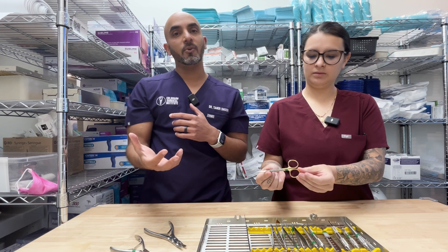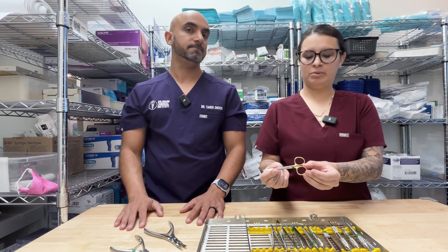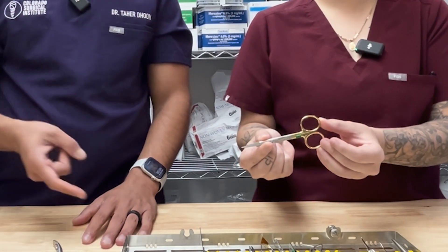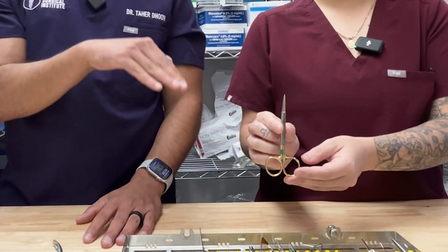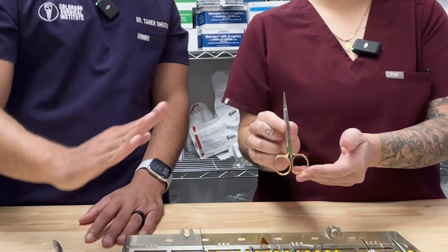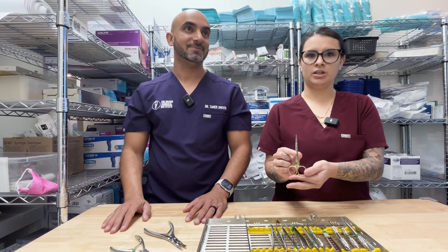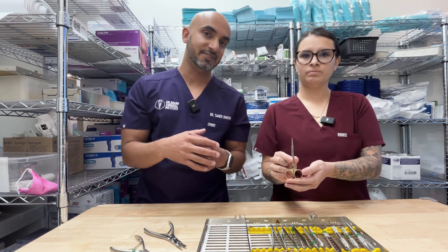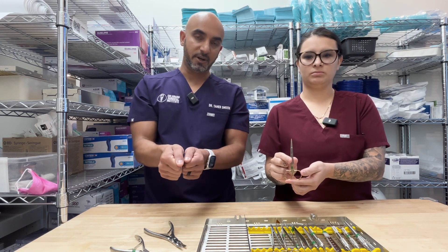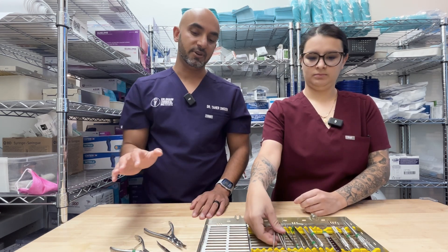These are our surgical scissors. Sometimes you might want to keep one or two in your kit — we just use one. We use them to cut excess tissue, but basically to cut suture, and also to cut PRF. You see how this one has a curve to it? With curved iris scissors, when you go to cut your sutures, you want to go in with that curved part pointing up — it makes it easier versus having the curved part facing down. Cut them as short as possible so they don't bug the patient. And when you're suturing, try to pull the knot to the buccal, because that way the patient's not going to feel the knot with their tongue — it drives them nuts.